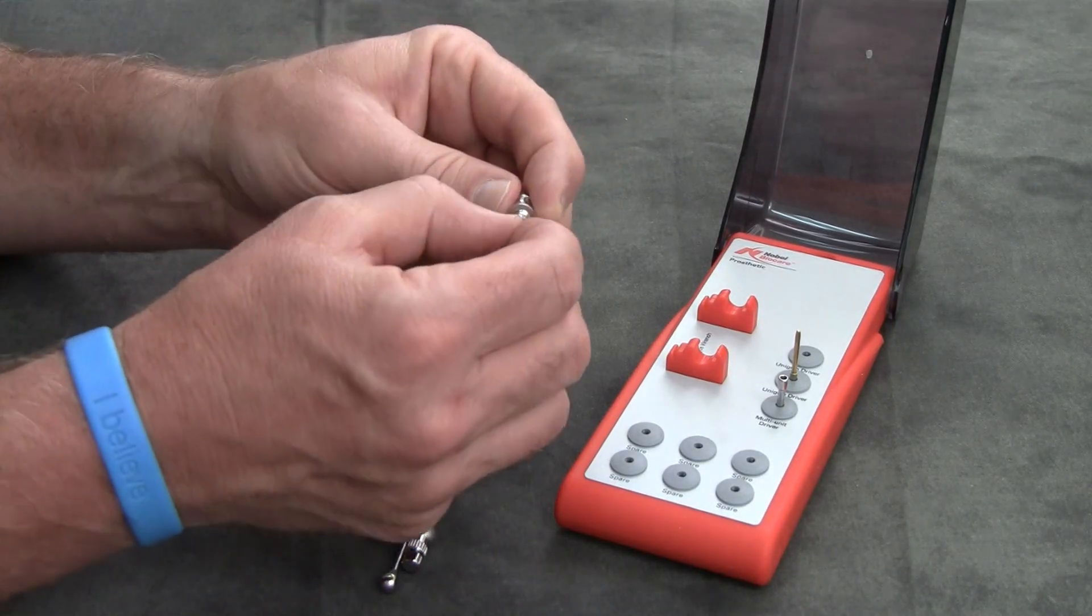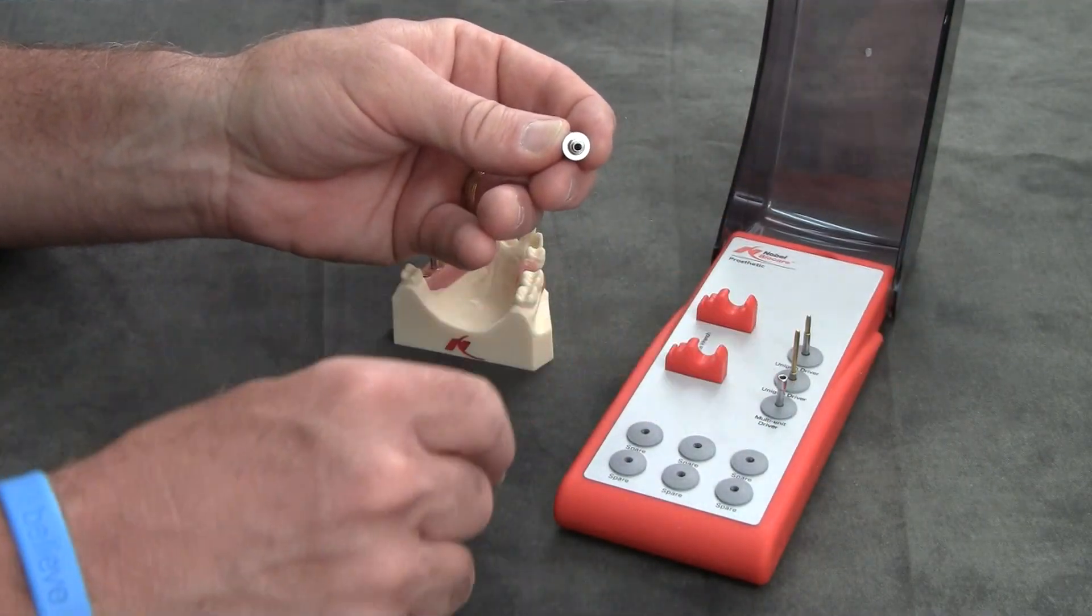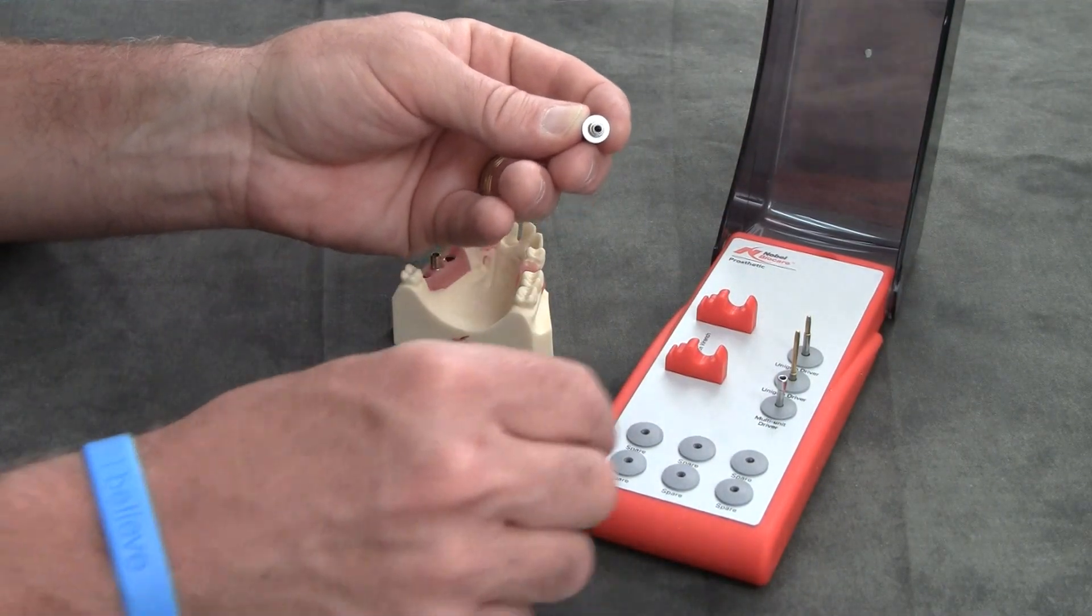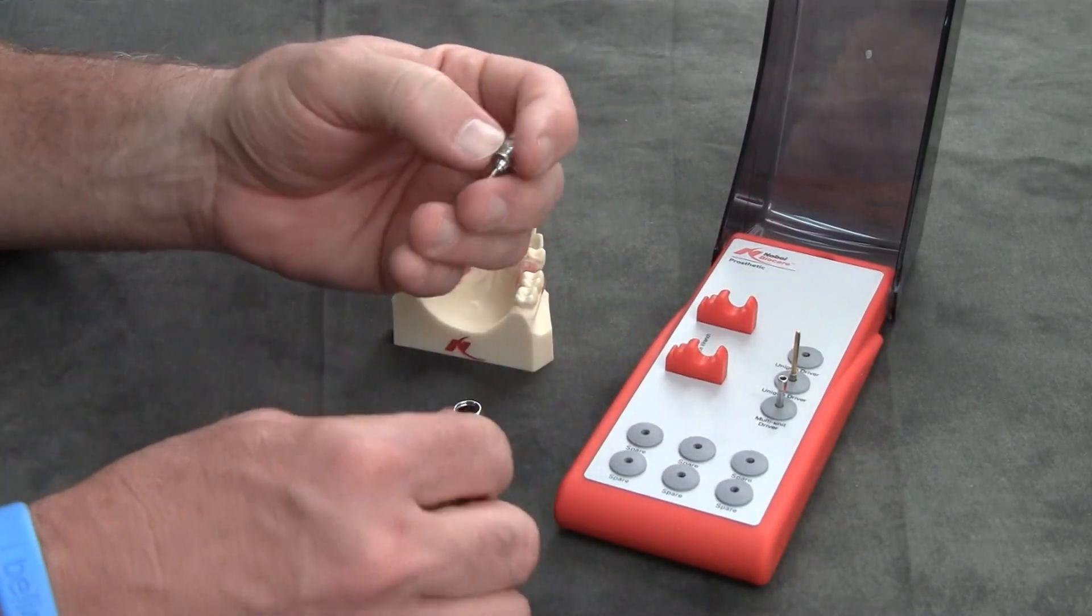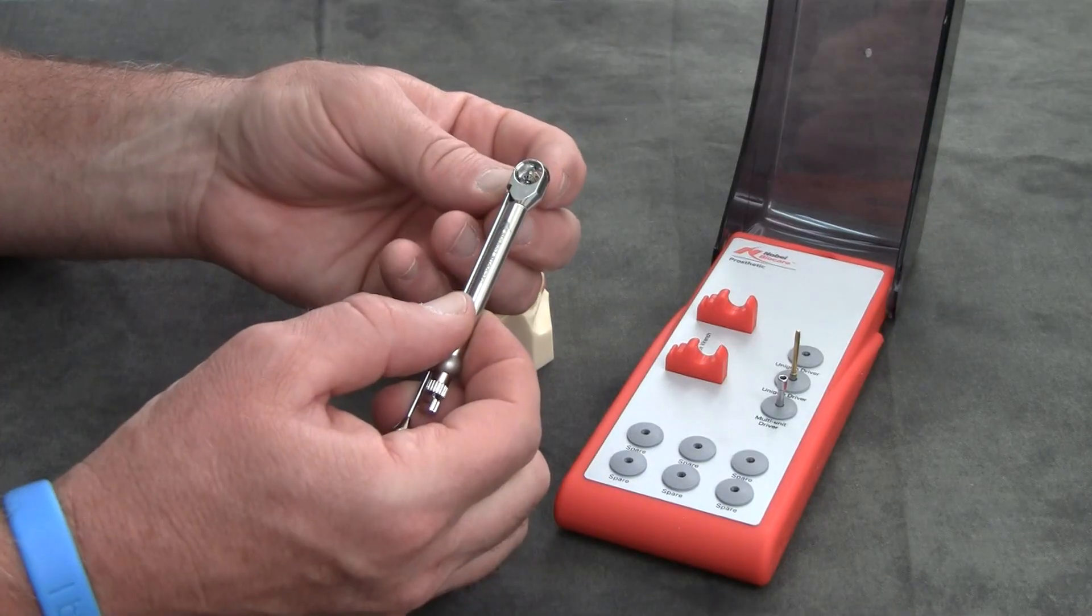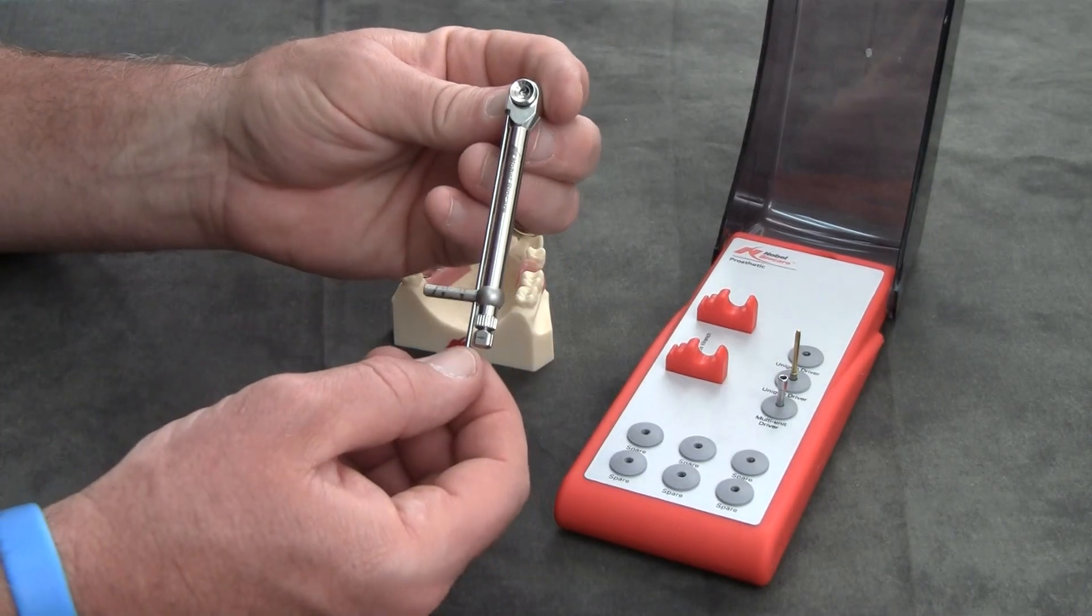To release, simply pull out firmly and then utilize either the long or the multi-unit driver. Now it simply fits in from the bottom, making sure that the Nobel BioCare logo is on top.